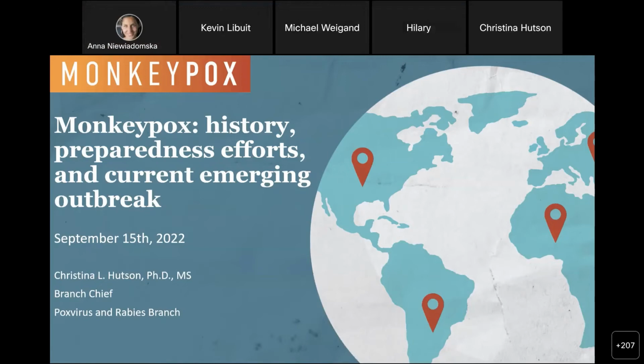And they actually made this so that it would work with many different PCR tests, both orthopox generic and monkeypox. And my understanding, at least at the start of the outbreak, and I believe this is still true, is that it's actually free for individuals to get. They just have to pay for shipping. And this shows the different targets that it works with. And we actually tested this within our lab with our 5 different PCR tests, and it worked quite well.